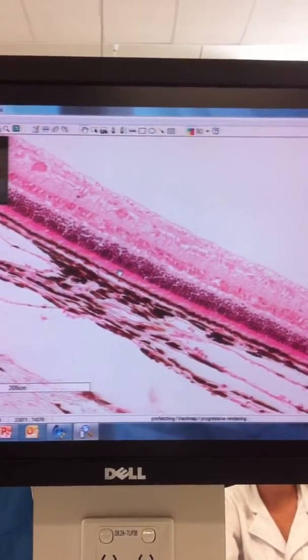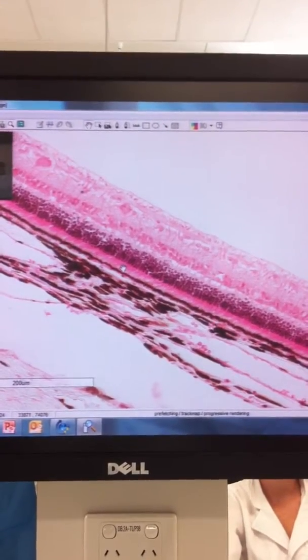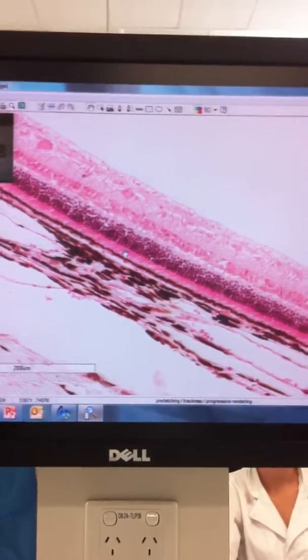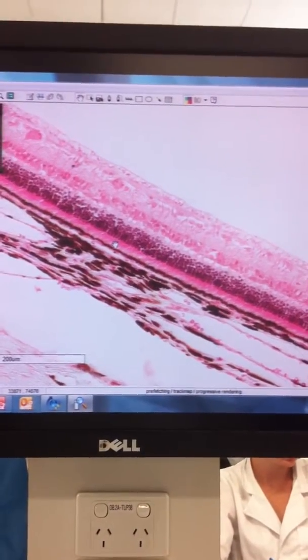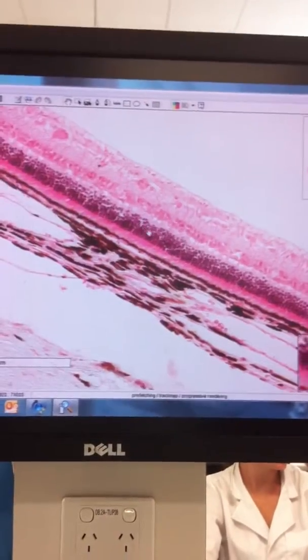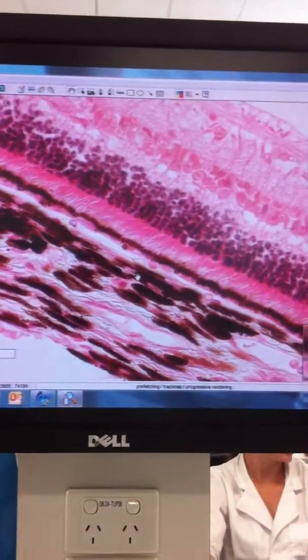Now, I'm looking at my notes, and the structure in the actual chapter 5. Look at that diagram. I'll just find out what diagram number it is. Diagram is 5-6, and it's basically the structure of the retina pretty well. So look at that diagram, look at this picture as you're doing it, and I've gone as high power as I can get on the retina.